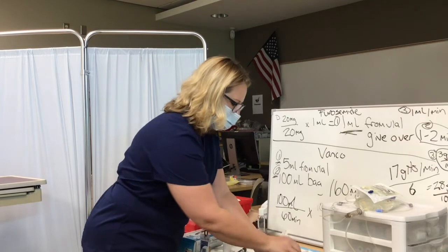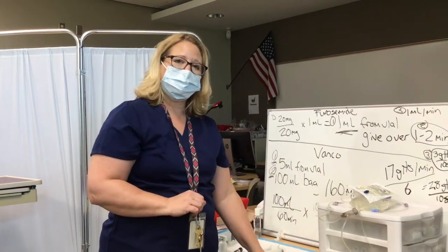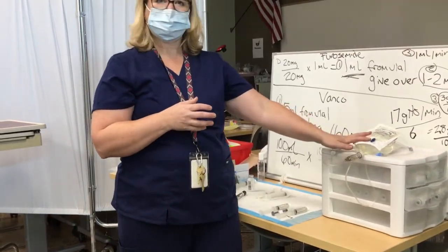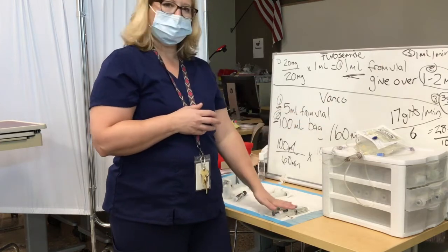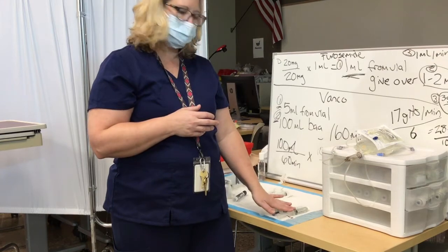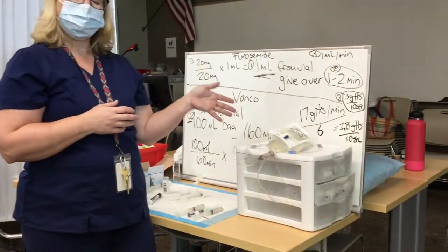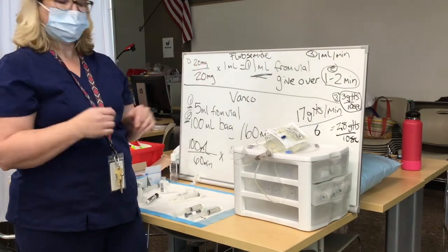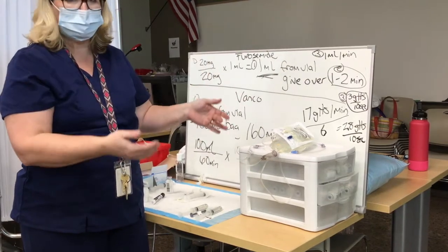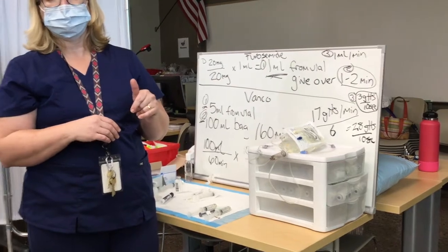So I like to med flush. And for this one, I'm going to give the furosemide first because it's always better to give a med that you have to push first before a med that's going to run for an hour. You want to go ahead and get your push in first. So I'm going to flush, med, flush, and then because I've used the flush here, I don't need to flush before this one, because you should always remember, flush, med, flush. But if you've finished with a flush and then you're hanging another med, you don't need to flush again. So flush, med, and then we'll flush again when we're done, okay?